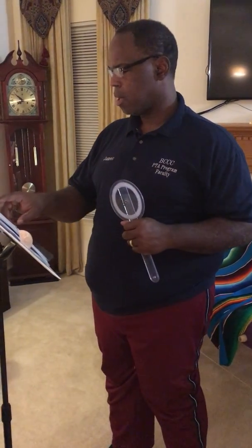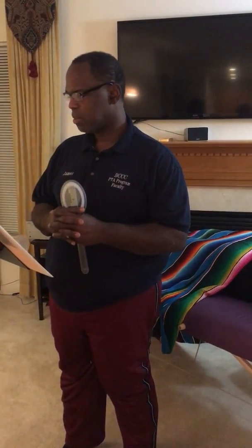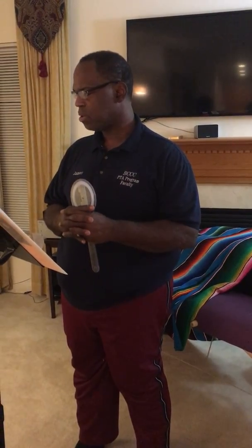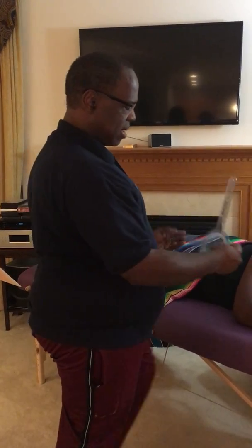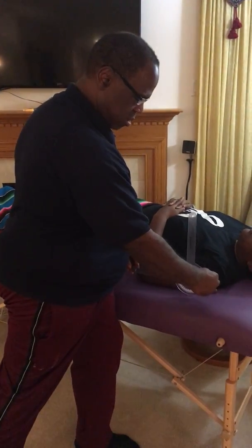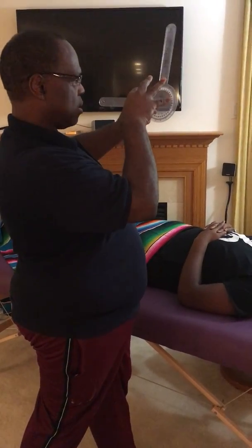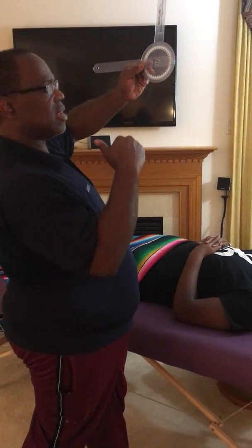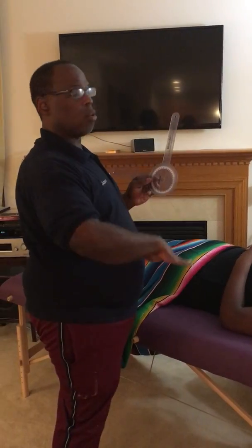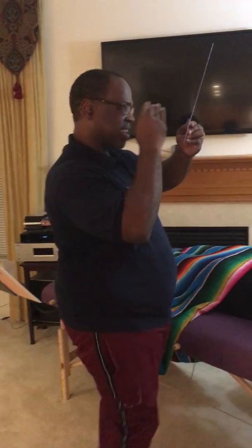Now, let's move on to part B. It says, always read at eye level. Use a high-low table, sit on a rolling stool, kneel, get up on the bed, so that we can see the numbers head on. If for whatever reason you're standing and you're working with the patient like this here, then I'm not looking at the number head on, so I need to kneel down. If for whatever reason the body part is high, then I need to get on a stool so that I can see the number head on. All right, so stool or raise the bed, do whatever you need to do so that I can see it head on.